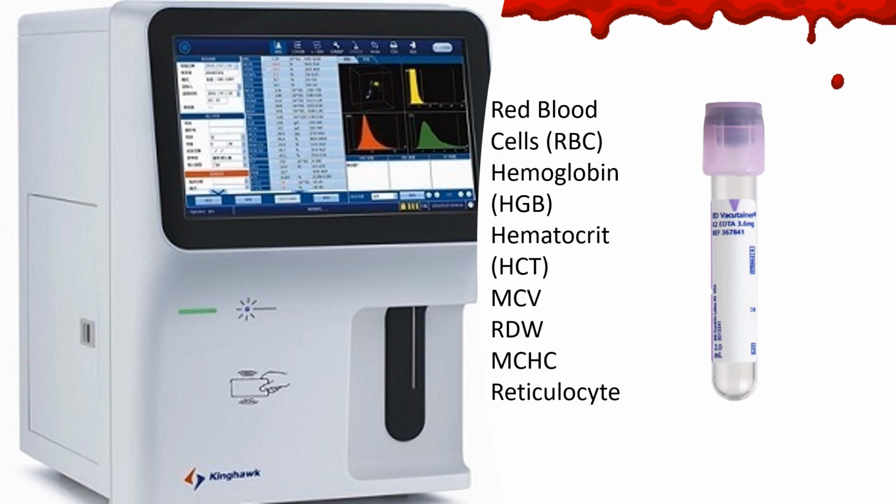If the blood test is not being inverted at the normal or standard frequency, that will also yield an inaccurate blood test result. So, si nosotros o el que está sacando la sangre no llena el tubito de sangre hasta el nivel que tiene que estar lleno, no lo invierte en el ángulo que debe de estar invertido y no lo lleva a la frecuencia que debe de estar invertido esto, todo esto va a causar un falso error en el resultado de la sangre.